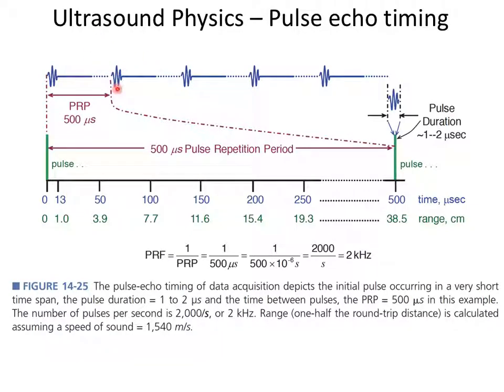And so when I do my next ping, I basically shut off the listening, and we just ignore what's coming back after that. Anything deeper, right? We'll just ignore it, send out a new ping, right? And look again at the depth down here. So any question about that? In this example, those pings are coming out at 2,000 per second, and we're listening in that 500 microsecond approximately window after each ping. Okay.